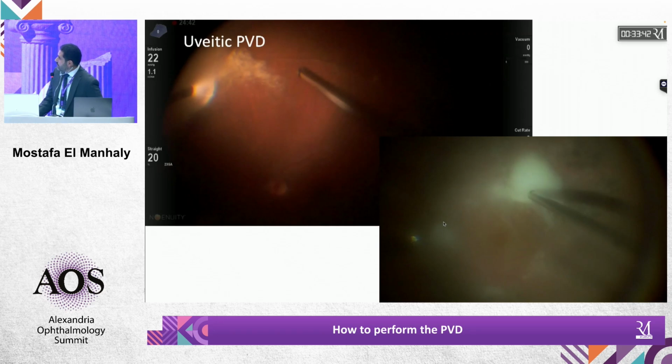Well, in the endophthalmitis case, this is just subhyaloid pus. It may be combined with retinitis. Could be underlying retinitis. I don't see hemorrhage. So will you attack this area?